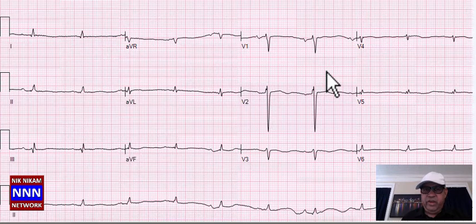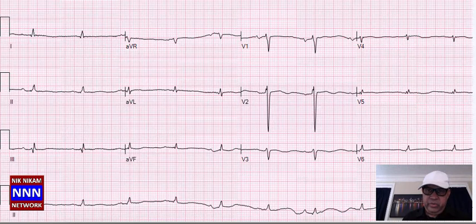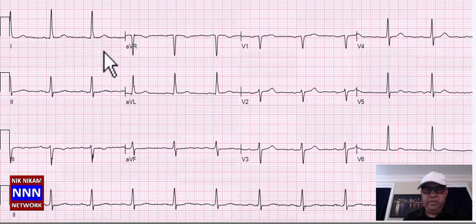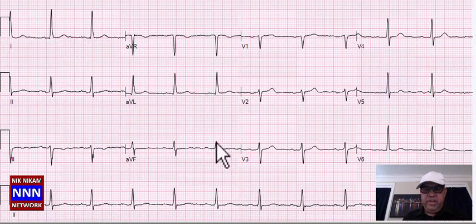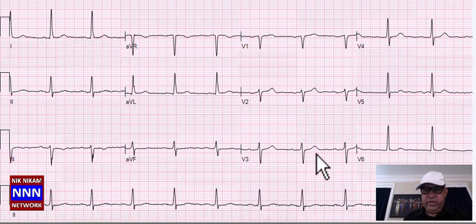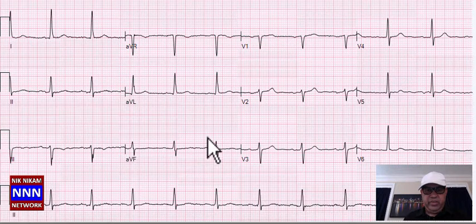Here we have a regular sinus rhythm, rate of 66 per minute, some flat T-waves but nothing really spectacular. R-wave progression seems okay. Inferior leads are all right, no evidence of previous infarctions.